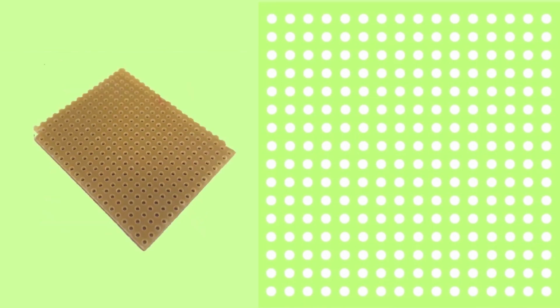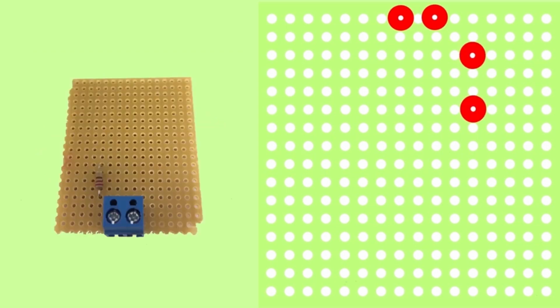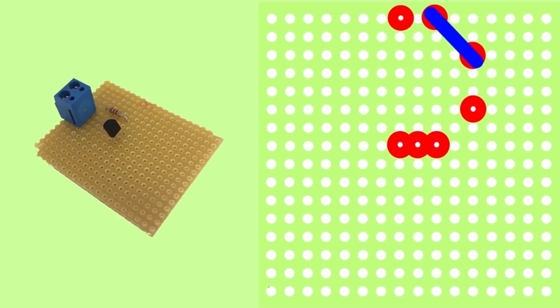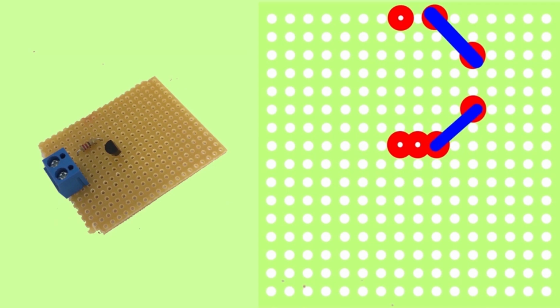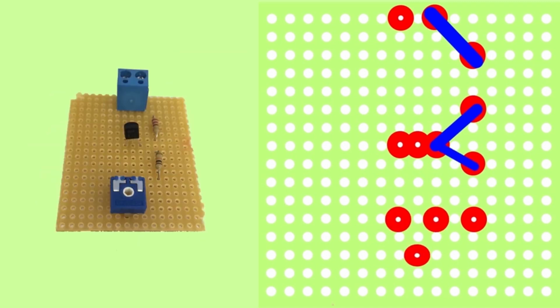For this, we need the gun and we also need the tin. So, first of all, we will start with the output. Output will be connected to the 470k ohm resistor. It will be soldered in by these two points that you see on the board. Now we will solder in the resistor to the transistor, and to the same pin we will also solder the other resistor, that is the 33 ohm resistor.